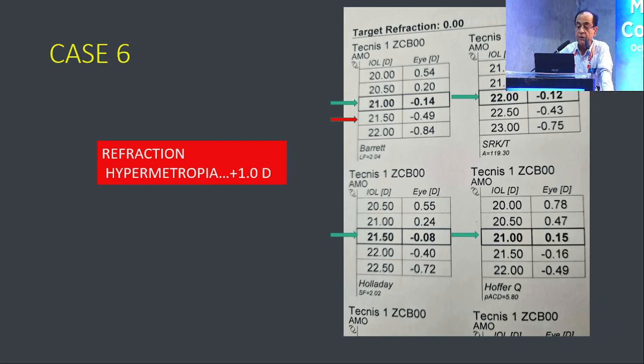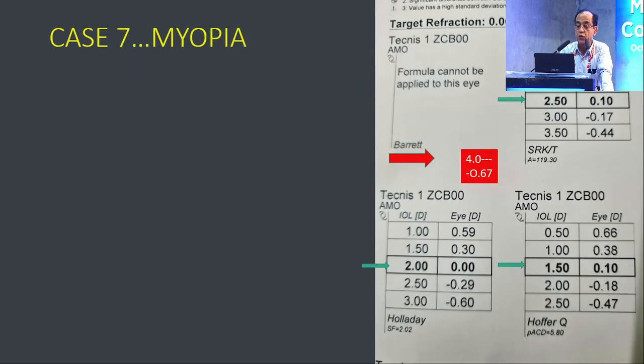So this is again, if the patient has got the same 21 diopter power, but if he is myopic, I'll go for 21. If he is hyperopic by 1 or 2 diopter, I rather make this patient use half a diopter more if the patient is hyperopic and I'm getting emmetropic power. So the refraction has to be taken into consideration.